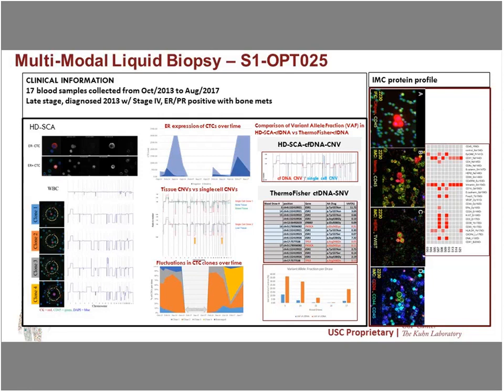On the right side shows our result of targeted proteomics using imaging mass cytometry with 40-plex imaging through laser ablation and CyTOF.